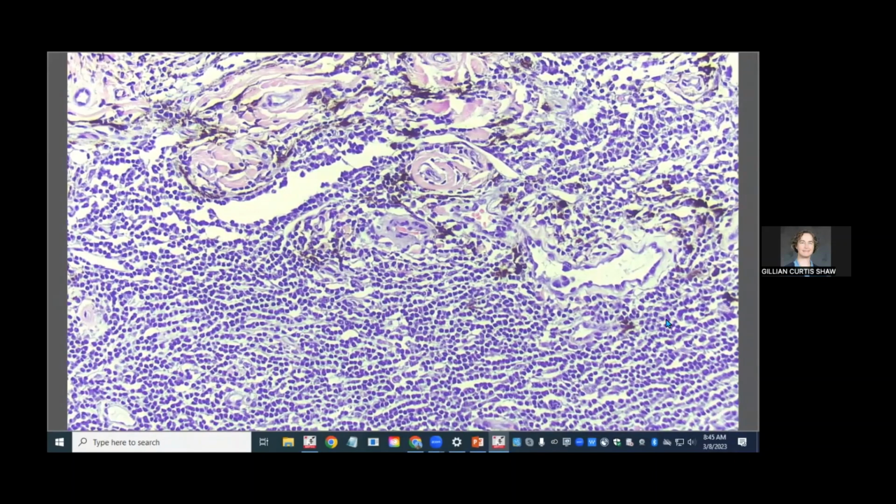So in this case, it reminds me a lot of cats. Briefly talking about domestic cats, in their chronic uveitis, they will sometimes develop discrete foci of lymphocytic inflammation, up to and including a follicular anterior uveitis. Basically, they can develop well-differentiated lymphocytic follicles in their iris.